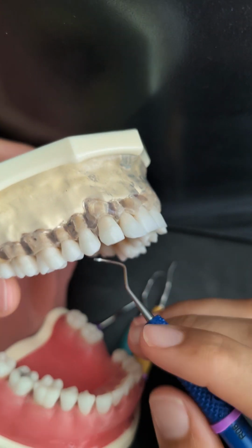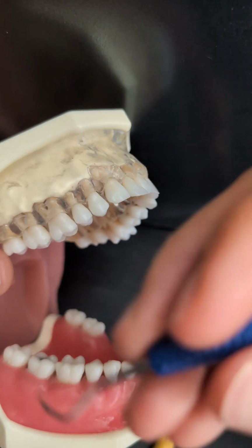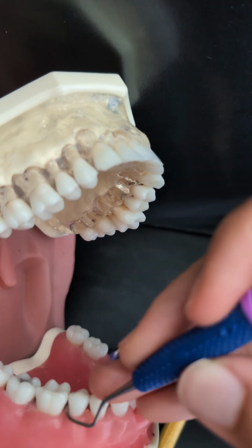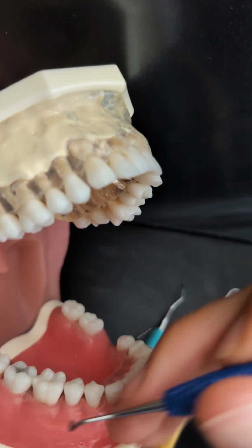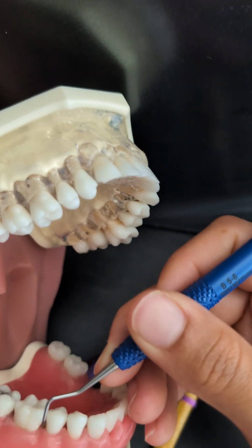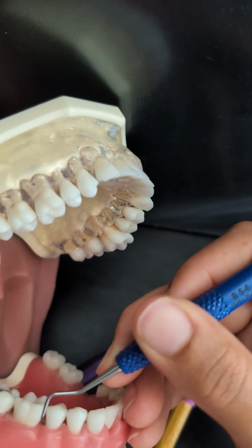To find the correct working end of this instrument, we are going to place the tip of the instrument interproximally, and we can see that this way it is like hugging the tooth, so that's not the correct way. Now we're going to place the tip of the instrument interproximally, and we can see that the lower shank is parallel to the long axis of the tooth, so this is the correct working end for posterior teeth.